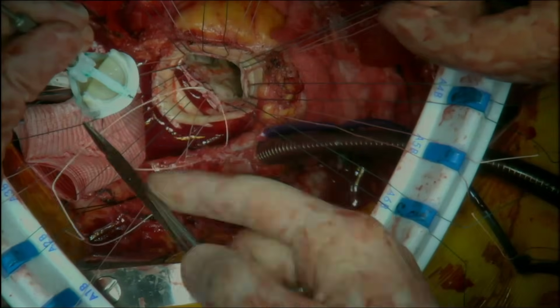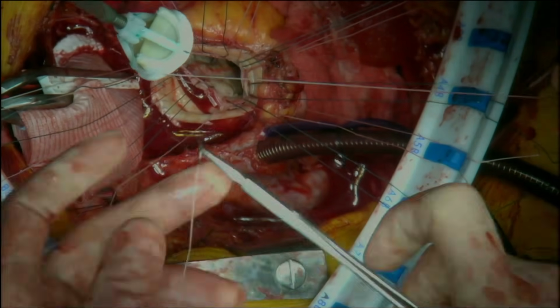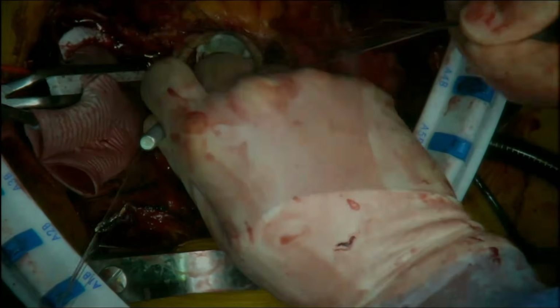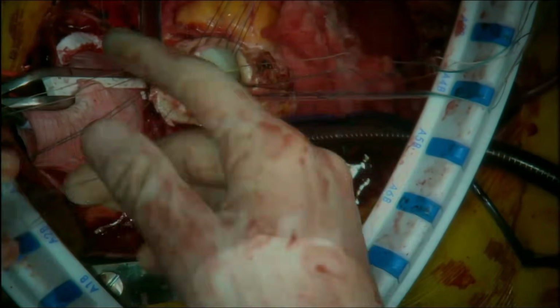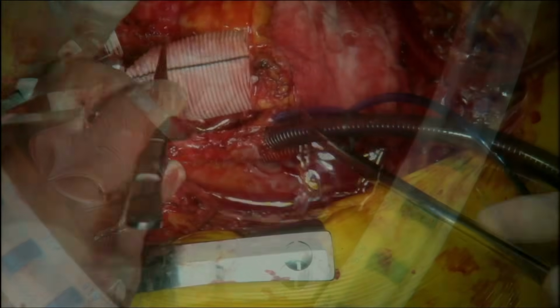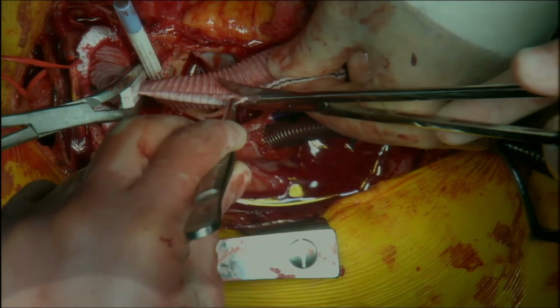The bioprosthetic aortic valve is seated and secured into position. The conduit is trimmed to the appropriate length.